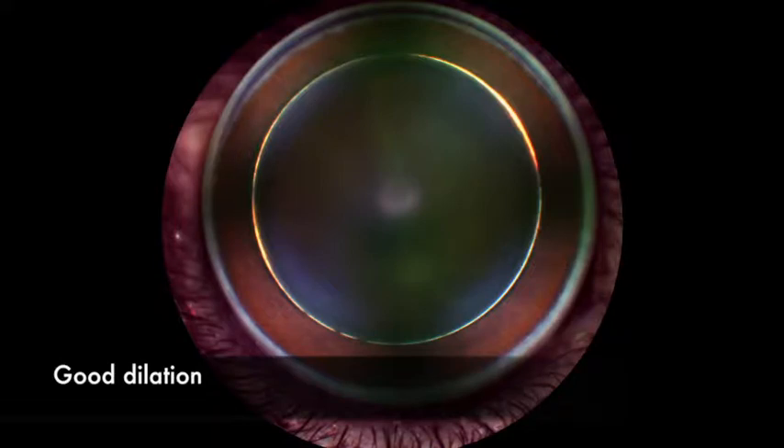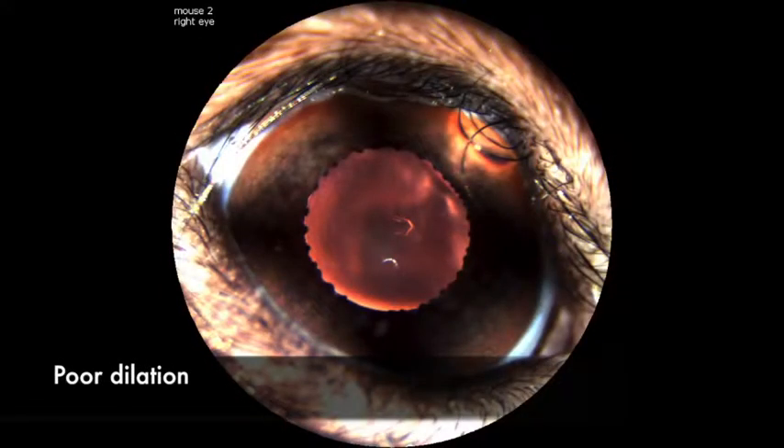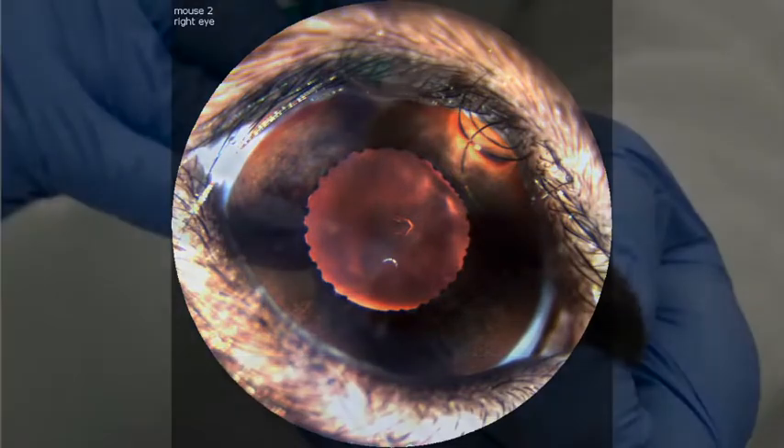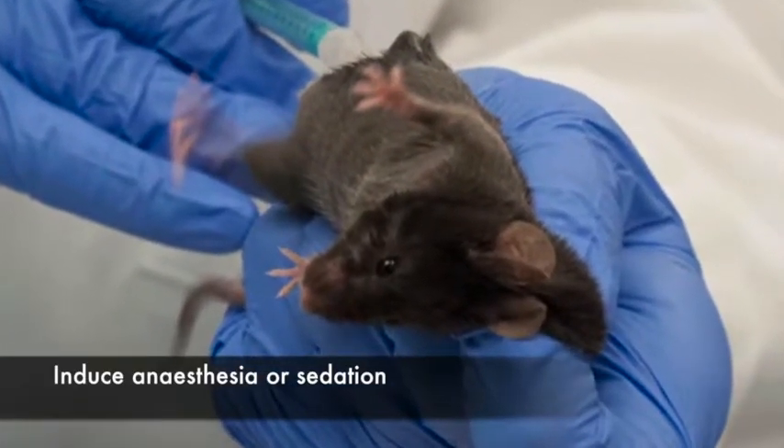Be sure that the pupil is maximally dilated and does not constrict or get smaller as a response to the light. Induce anesthesia or sedation according to your research protocol.